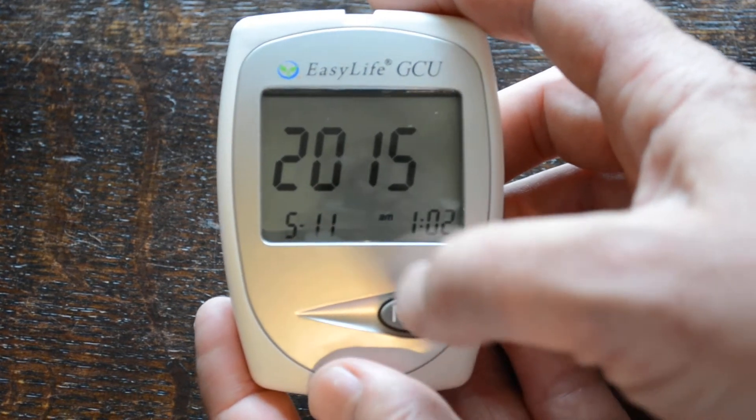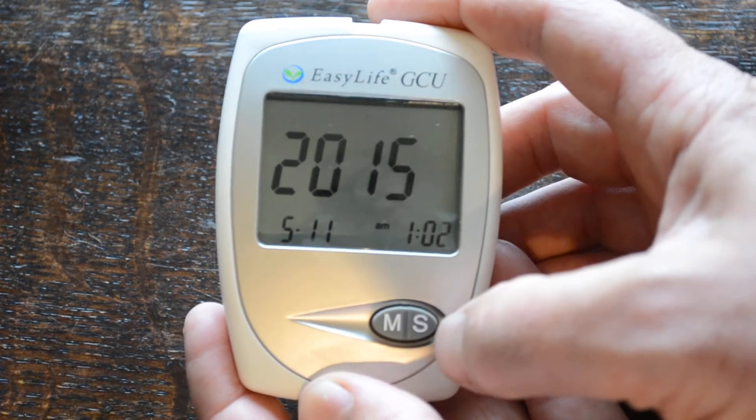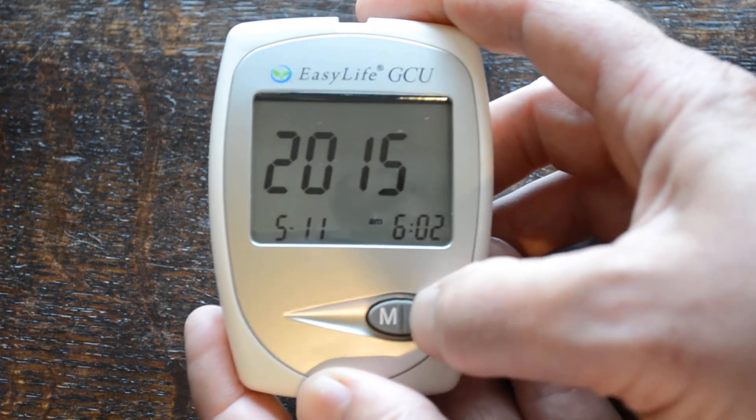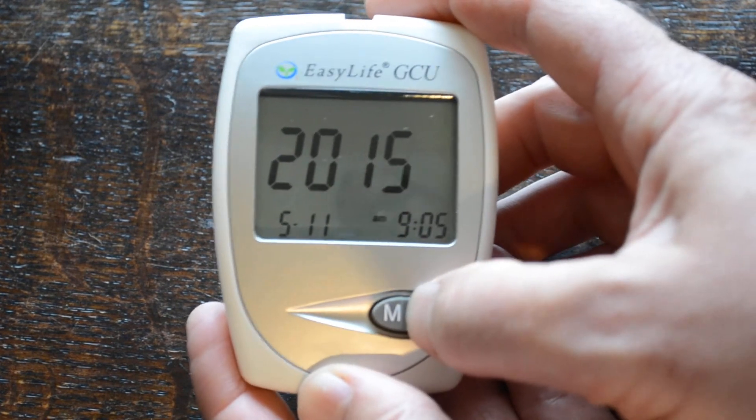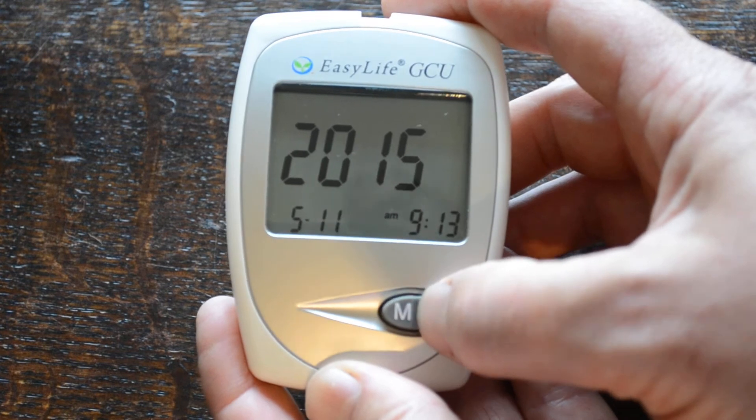Press M onto the time. The time is in a 12-hour clock sequence, so you've got 12 hours morning and 12 hours night. We're just going to manipulate this to 9:15.